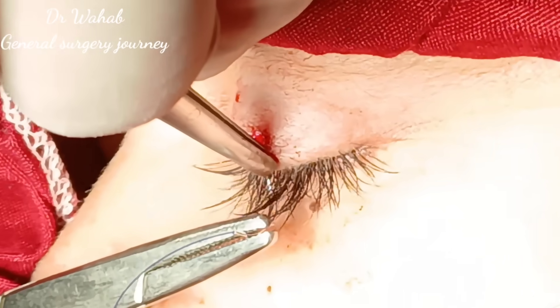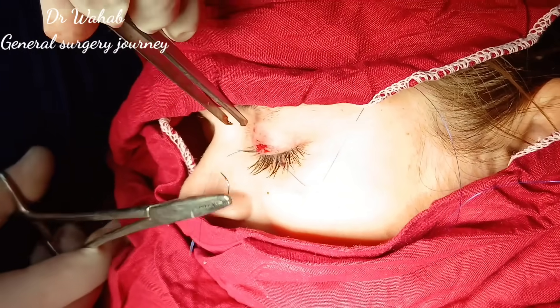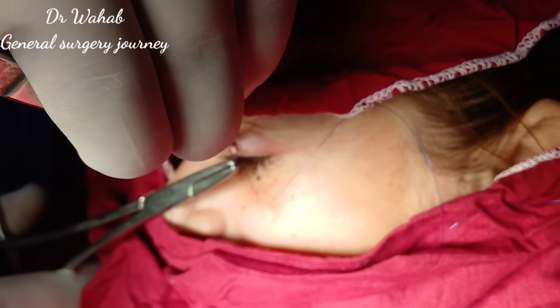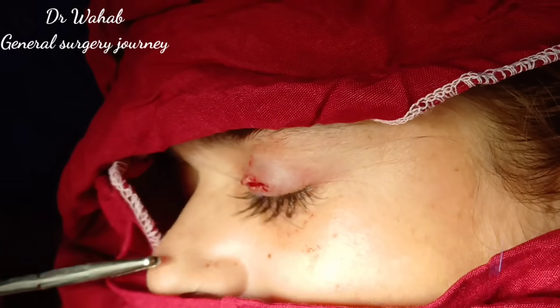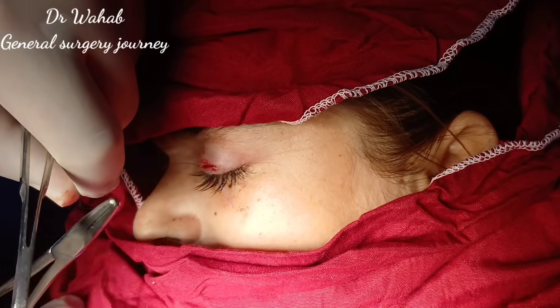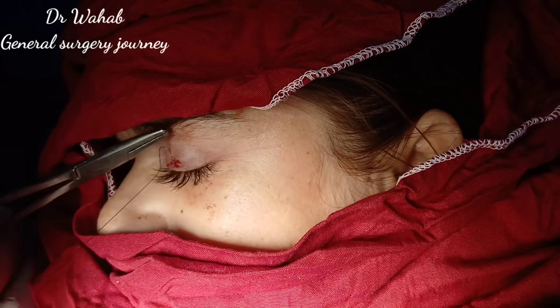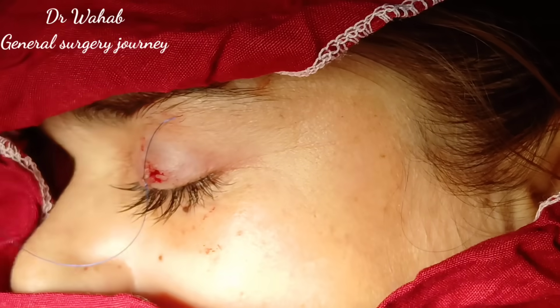We are now proceeding with wound closure. The skin edges are being approximated carefully and closure is being performed using 4-0 non-absorbable prolene suture. We are aligning the wound along the natural eyelid crease to achieve the best possible cosmetic outcome. Minimal tension is maintained across the wound to promote optimal healing.